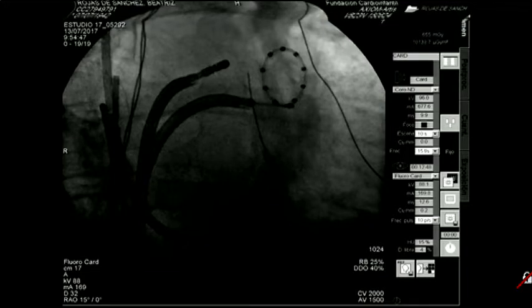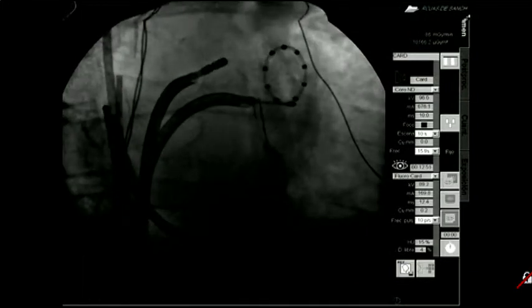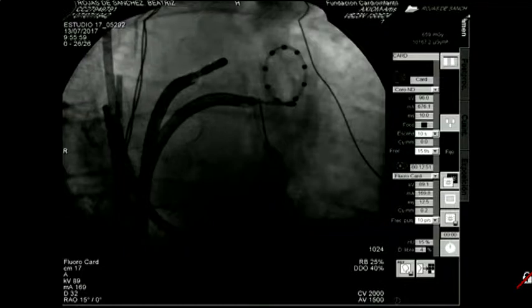What Dr. Shinkumar was saying is that apparently the wire is more distal in the Marshall vein. It seems that we are beyond the vein. The question is that the initial venogram of Marshall's vein we did with contrast injected in the coronary sinus is a non-selective venogram. As soon as we remove the wire, we are going to inject contrast medium through the balloon, and we can see the real extension of Marshall's vein.